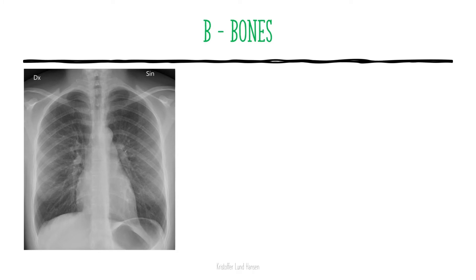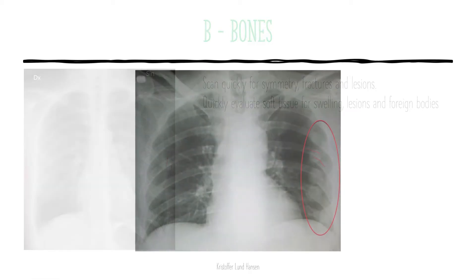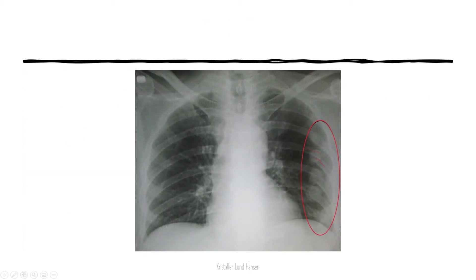Then we assess B for bones. This is a step that should be quickly looked over unless you have a clinical suspicion of a fracture. You scan quickly for symmetry, fractures and lesions, and quickly evaluate the soft tissues on the side for any swelling, lesions and foreign bodies. In this picture, you can clearly see fractures of many of the ribs — the ribs are displaced and you can see they have already started to form the callus.